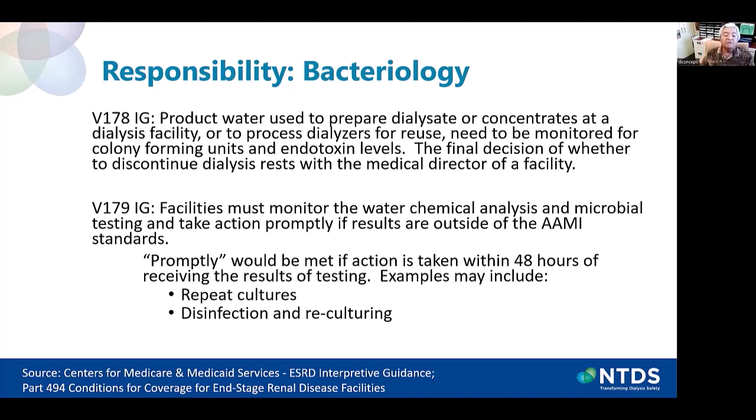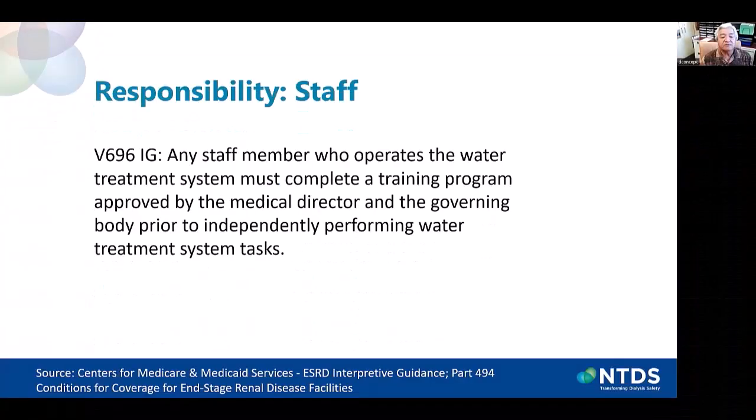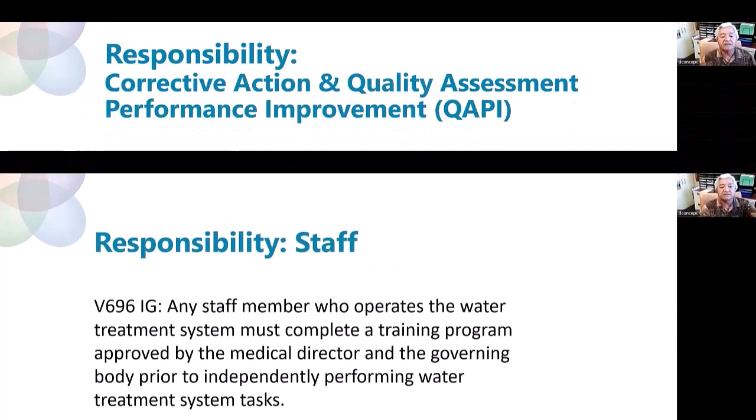The word promptly could be interpreted as repeating cultures or disinfecting the system, followed by repeat cultures within 48 hours of waiting results. Any staff member who operates the water treatment system must complete a training program approved by the medical director and the governing body prior to independently performing water treatment system tasks. Per regulations, an annual audit and competency must be performed on these individuals.